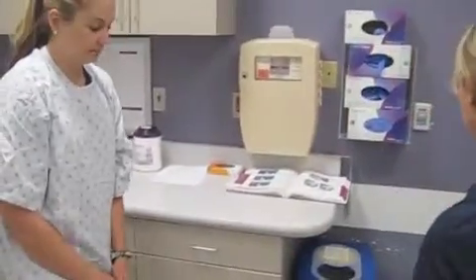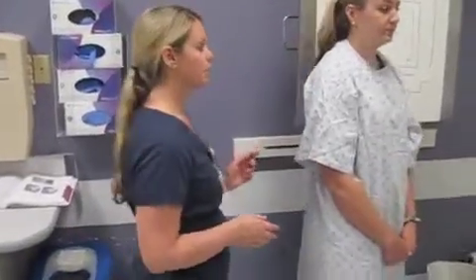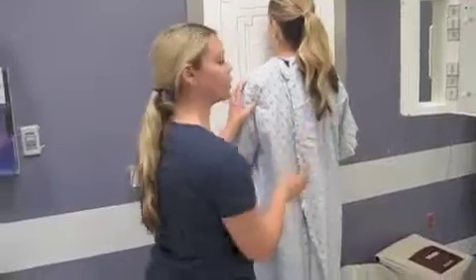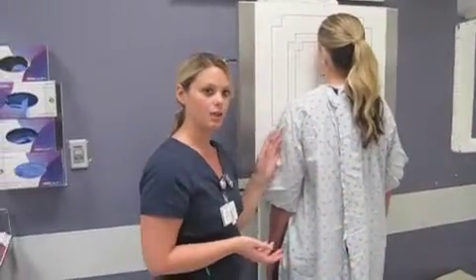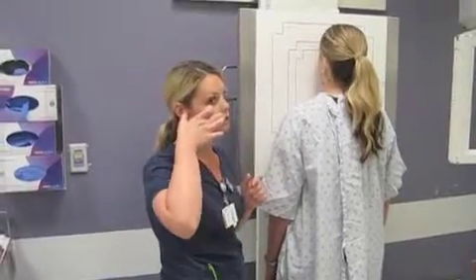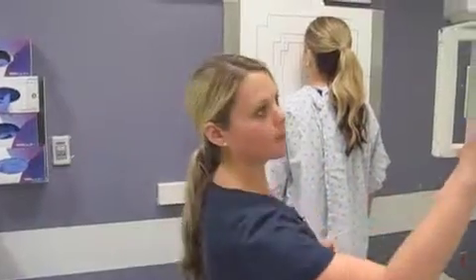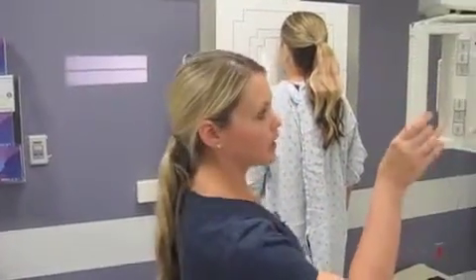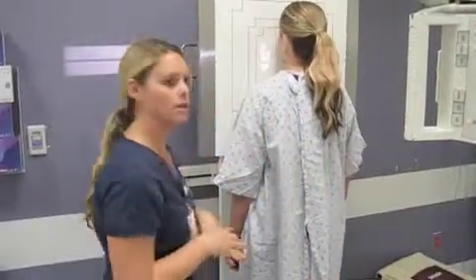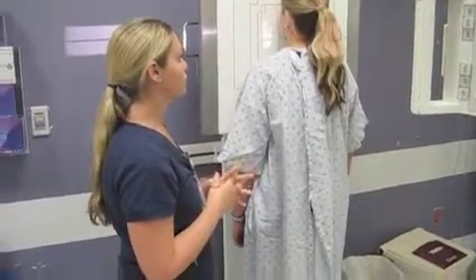So I'm going to have you come over here. I would also shield my patient. So for the first image, I'm going to do the PA. Her AML is going to be perpendicular to the IR, so that's right underneath her nose to the EAM. That's going to be perpendicular. I'm going to make sure and collimate down to just get the mandible. Also, the central ray is at the level of her lips.